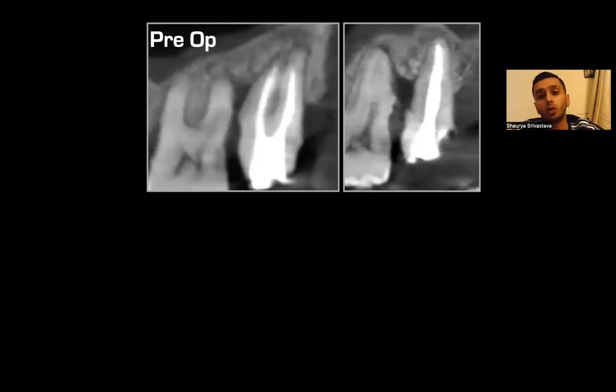But I said, okay, today let's just try something different so that we can cause minimal discomfort for the patient. So took the scan. As you can see, there are suboptimal root fillings. There's extensive bone loss on that mesial aspect of the 7, but there was no fracture observed. And the plan was simple. We're going to do a retreatment over here. But again, could I take intra-op PAs? It would have been very difficult because of rubber dam, RVG, patient has gag reflex, not possible.